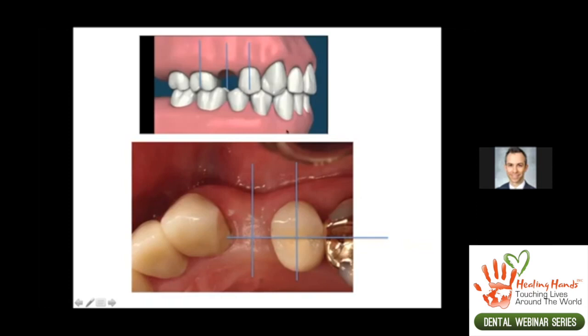And when we look down from the frontal aspect, from anterior to posterior, we want an implant in the premolar area, for instance, to typically have the center of that implant line up with the central groove of the teeth posterior to it. And again, it should be nicely lined up. And you can see here's an example of a patient where there's very minimal mesiodistal spacing. There may not be enough room for a normal looking tooth, but we may not have enough room for an implant.